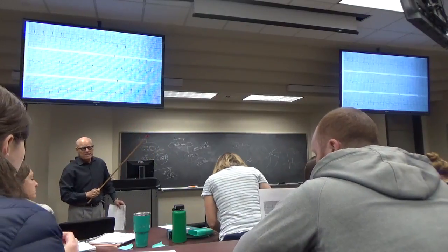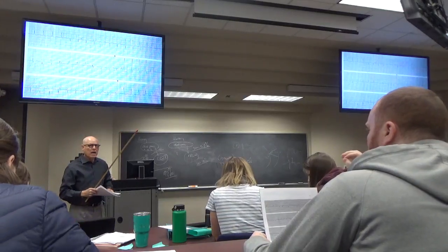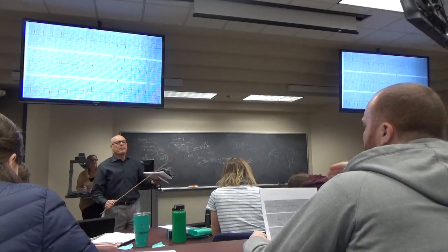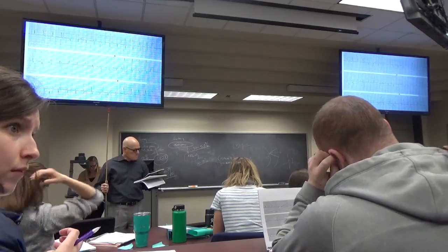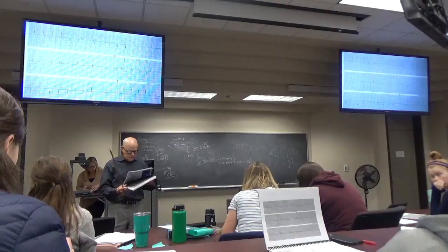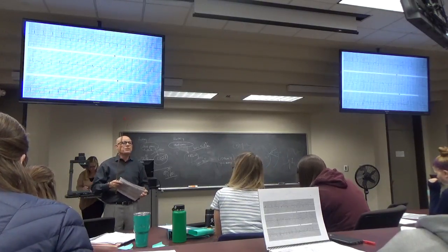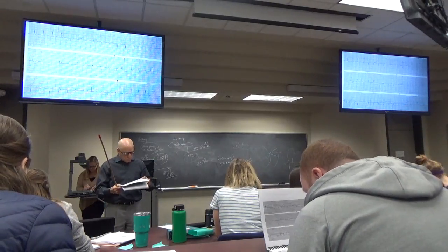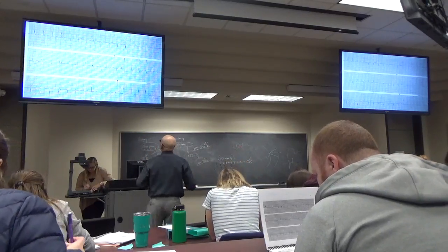If you can't find a P wave, is the PR interval zero, or do we not even count it? Oh, you can't count it. If there's no P wave, there's no PR interval. Okay. I think I got a PR, but I don't know if it's right. I put 0.28. I counted and said 0.28 as well. Where did you see that? It's in lead three. Okay, so look at lead three.